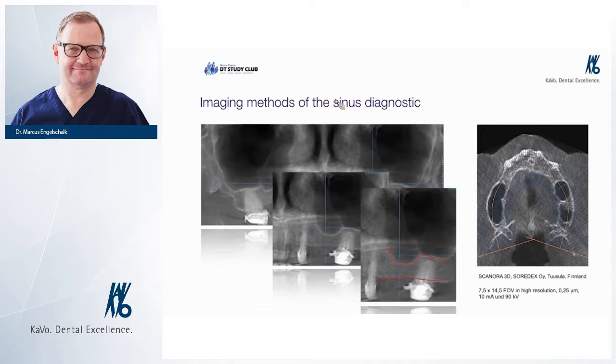And of course, we have the soft tissue. We have the swelling of the tissue. We have sometimes some liquid in the sinus. This is very important to see. But the problem is an X-ray always shows us the bony structure better than the soft tissue structures.